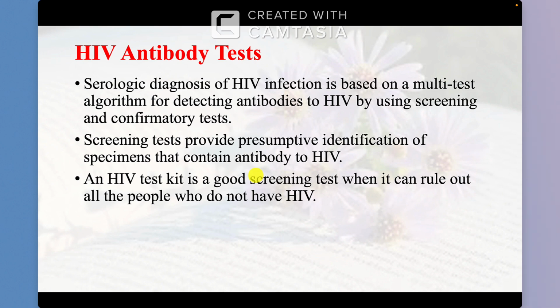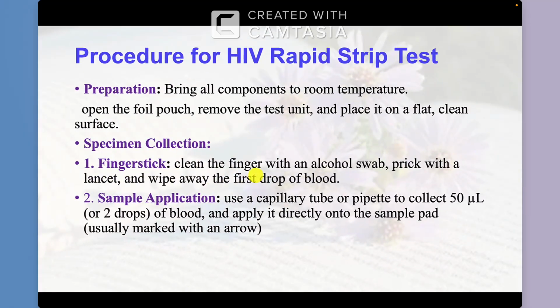Until now we cannot find a vaccine, and the drugs just delay or decrease the symptoms, but there is no complete treatment. The procedure here is a rapid strip test.